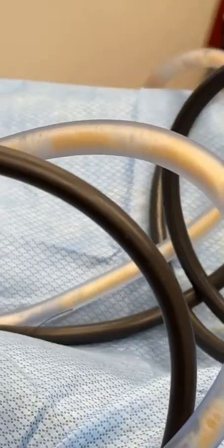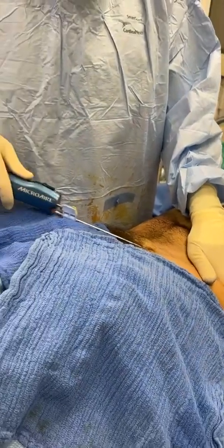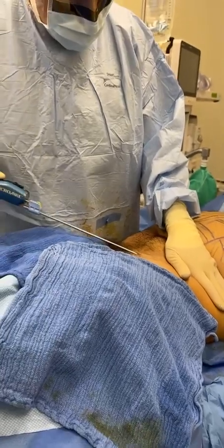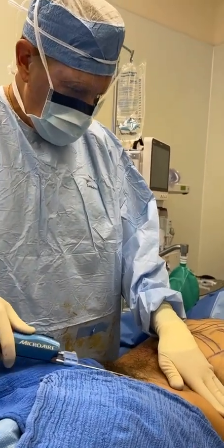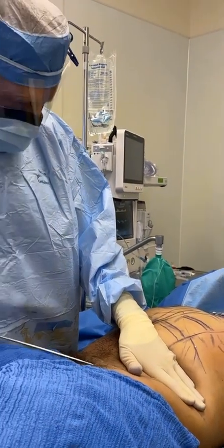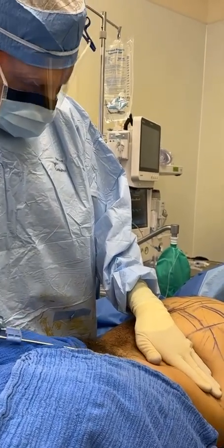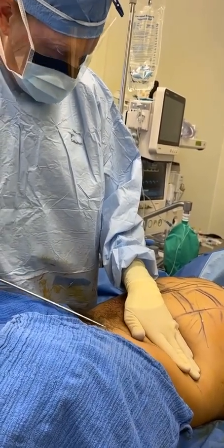Look at my movements over here. Even though I'm going deep there, pressing with my hand, going deep, my movements are very controlled. There is no unintended stroke. I'm marking the iliac crest here and pressing down with my hand. Yet we never had anybody have an intra-abdominal perforation, thanks to God, or intrathoracic perforation, or any kind of organ injury, and we want to keep it this way.